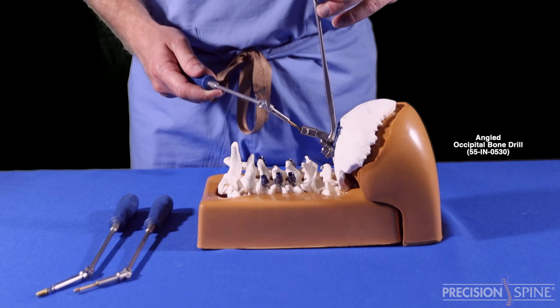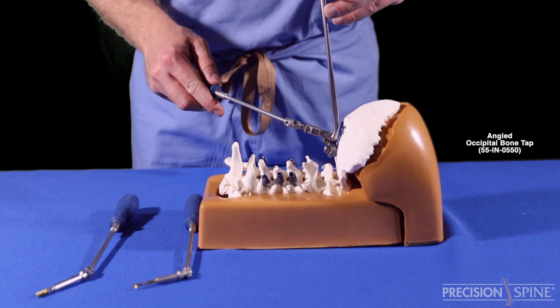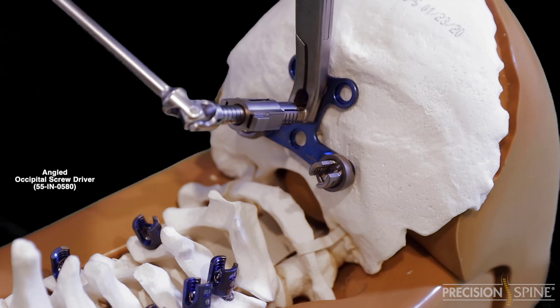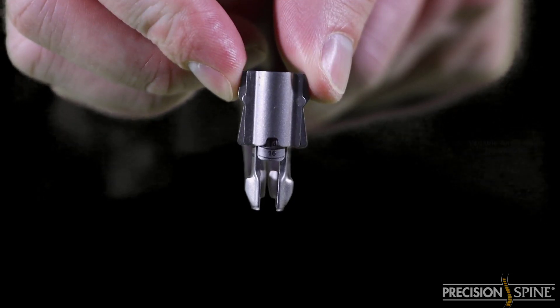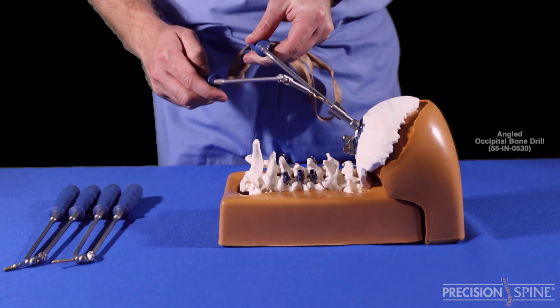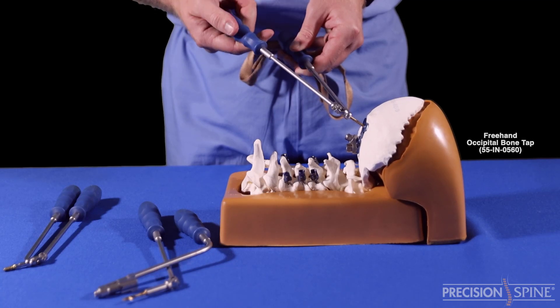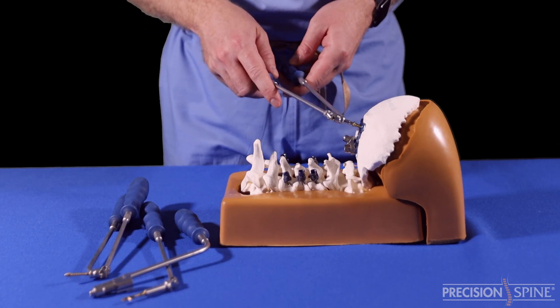The angled instruments may also be utilized through the all-in-one inserter. The remaining screws can be delivered using the variable angle guide with the straight or angled drill, tap, and driver. Alternatively, you can utilize the freehand tap and driver provided in the set. The freehand instruments are designed to work without the guides. Anatomy and surgeon preference will dictate what instruments are utilized.